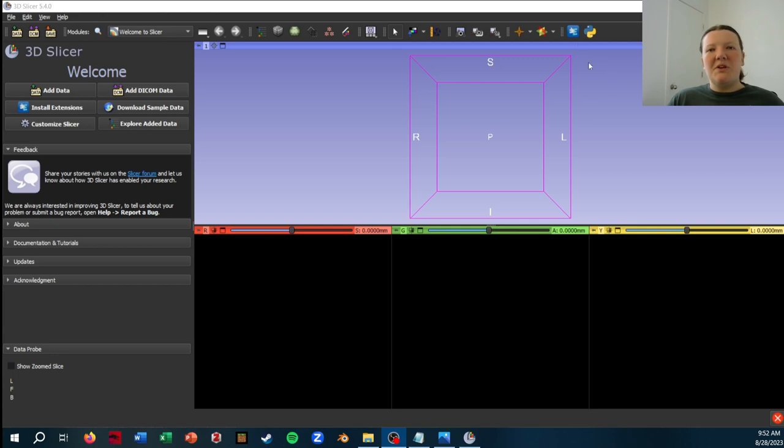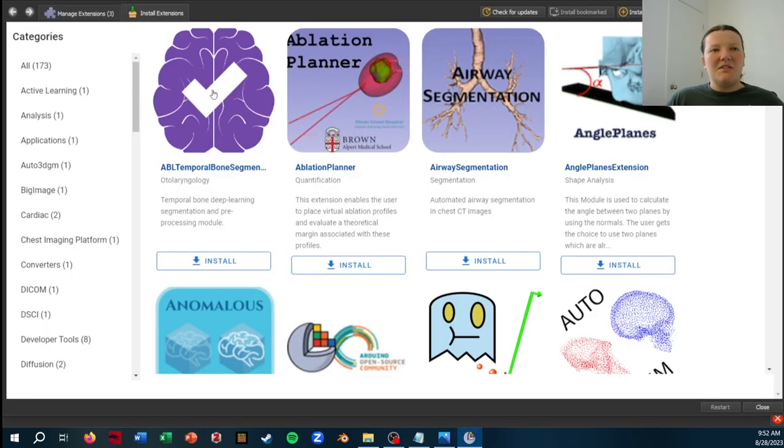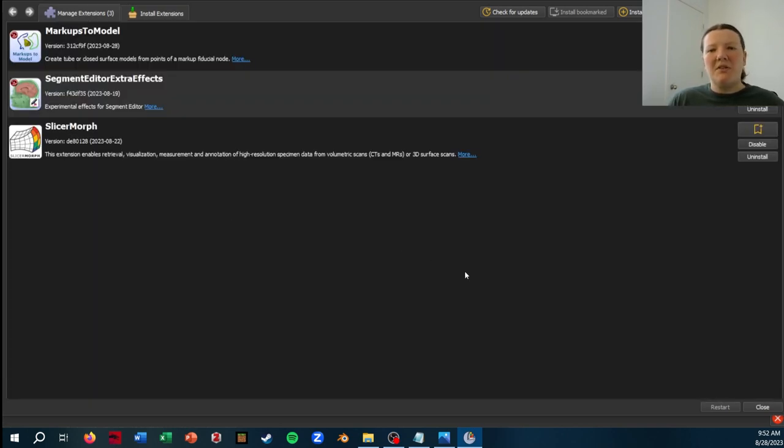So first you'll need to make sure you have SlicerMorph installed, which you can just do by clicking on Extensions, Install Extensions. I already have it installed, so I don't need to worry about that.